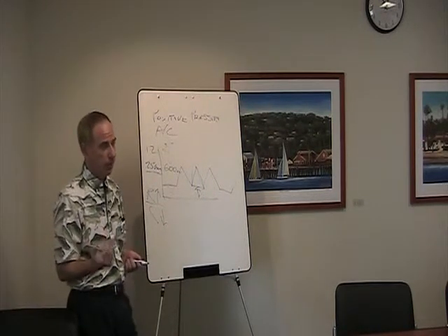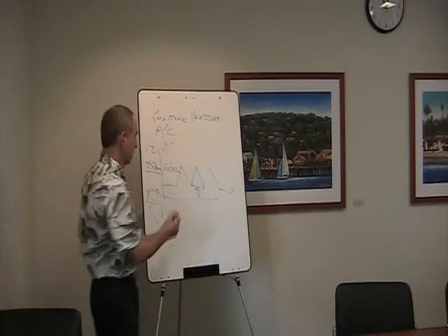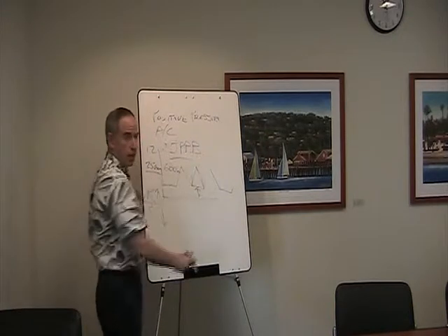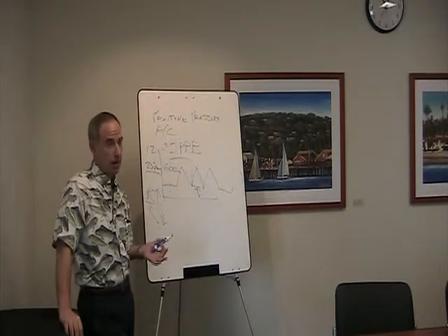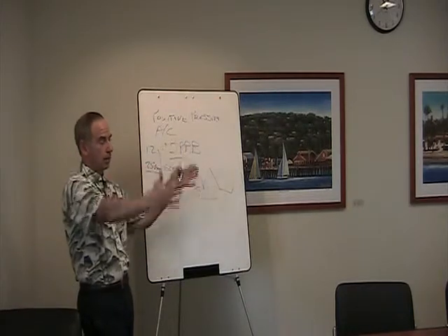Okay, so the only kind of ventilators that we could use were what were called IPPB machines. Has anybody ever heard of that? You've heard of it. So IPPB stands for intermittent positive pressure breathing. It was a little machine, a box about so big.